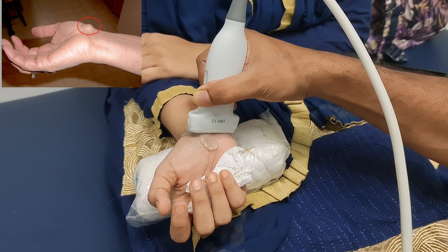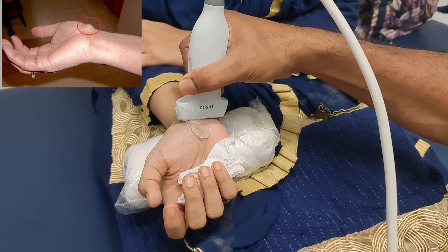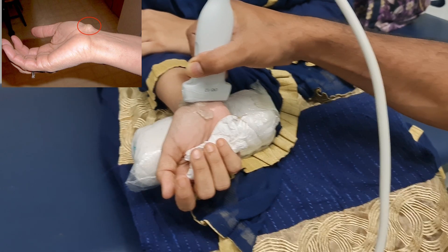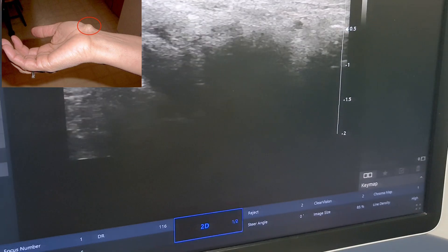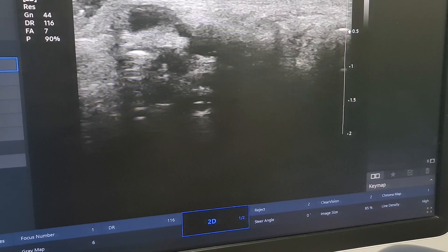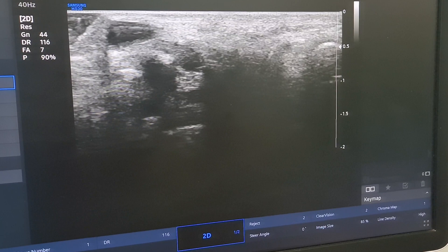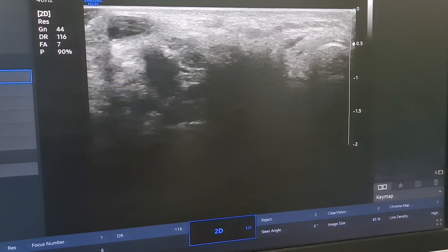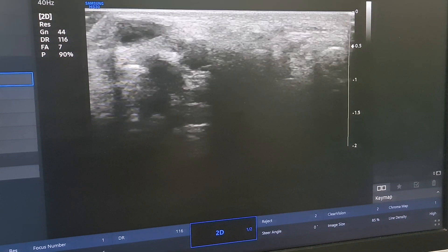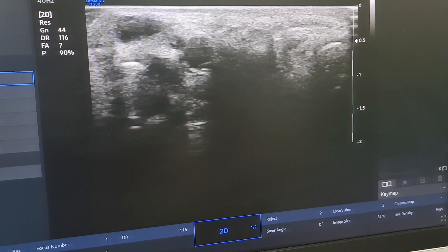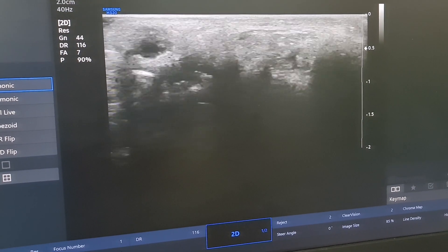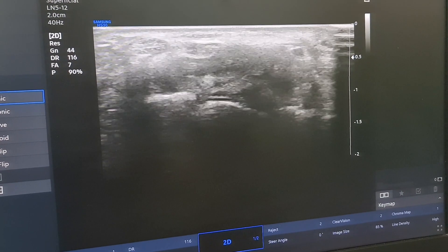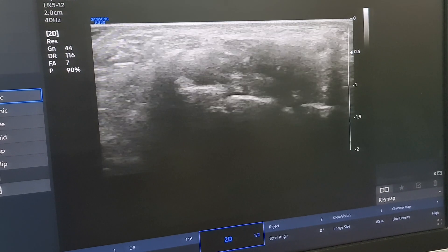Now we are observing the ganglionic cyst in the right wrist. The ultrasound picture is very clean-cut. It's very important to identify the median nerve alongside or the attached structure of the cyst. First of all, we can identify the median nerve here — this is the median nerve in medial position.